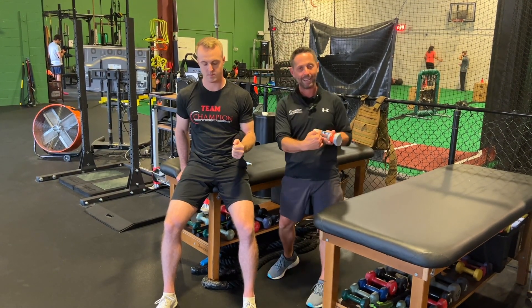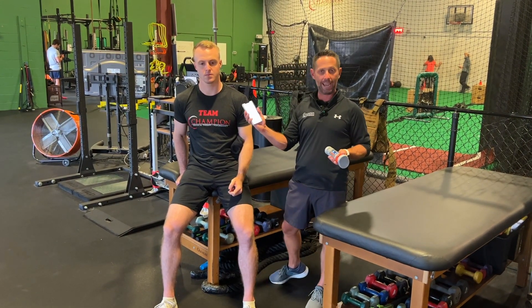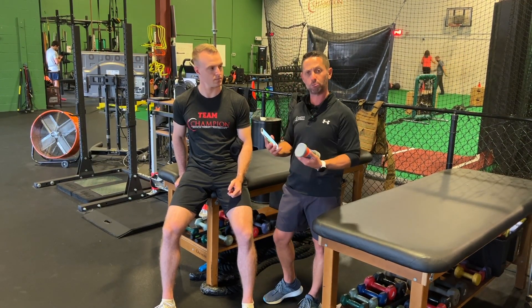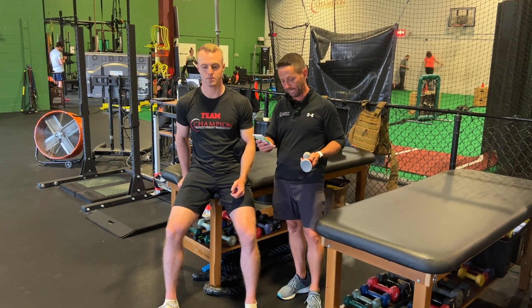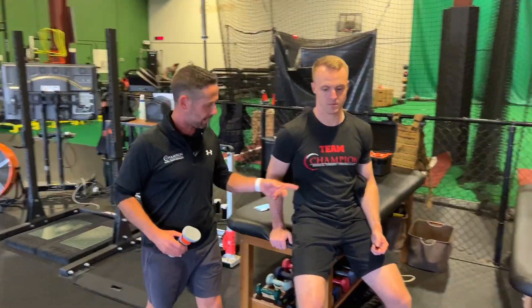The handheld unit tells me the amount of force he's pushing, and it's also recorded in the app, which is great because I can look at various reps and see the difference from rep to rep. That data will store up into the vault hub so we can look at it in the future. For comparison, I'll probably do that three times on each side.